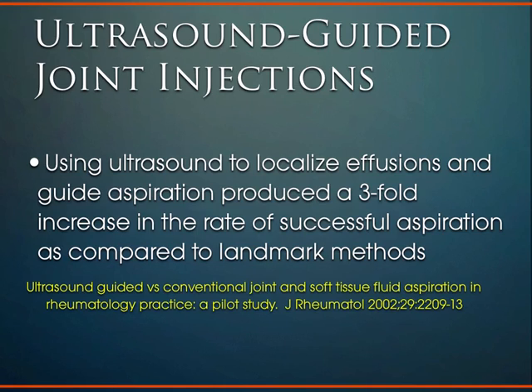So I mentioned earlier in terms of the application of ultrasound in the office, one of which is using it for image guidance or for joint injections. And we've been doing joint injections for a long time using surface anatomy and your knowledge of that surface anatomy to guide your injection and identify the joint space, the tendon sheath, and your soft tissue structures.